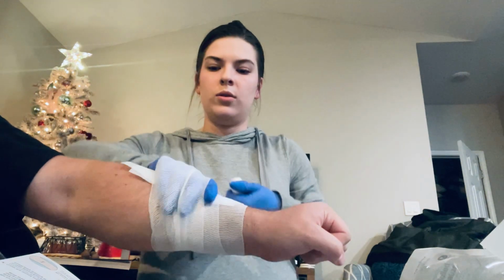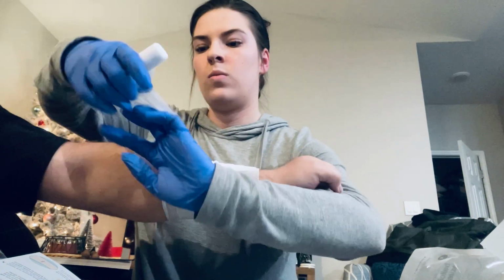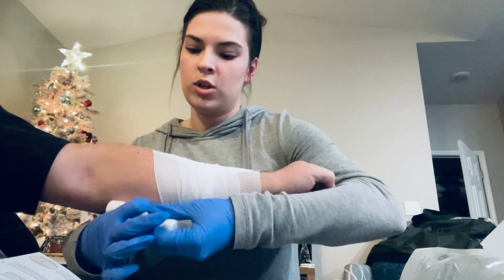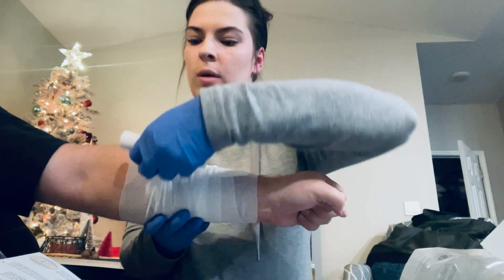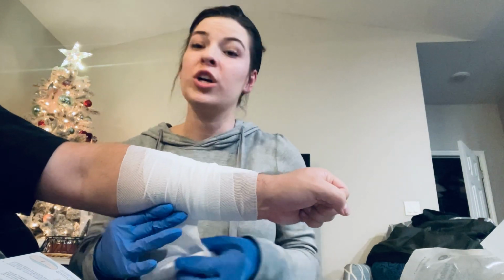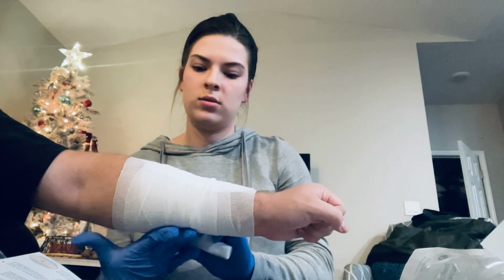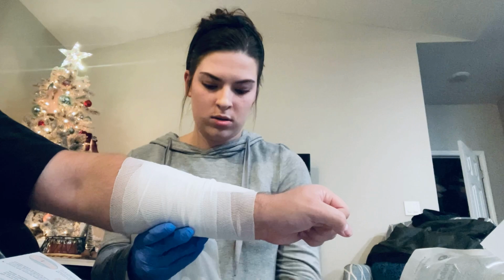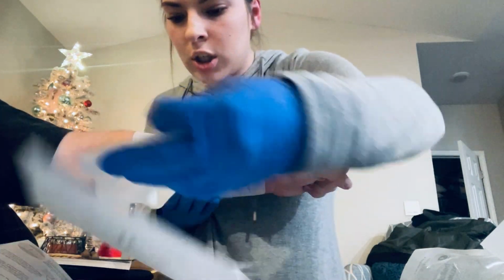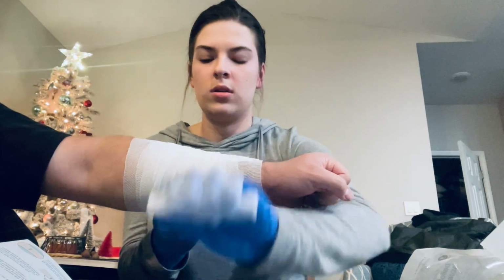And you need to continue to wrap all the way along the dressing to be able to secure it properly. And once you make it all the way down to the end, you want to, for good measure, go back across and continue with the pressure to ensure that the bleeding will stay stopped.